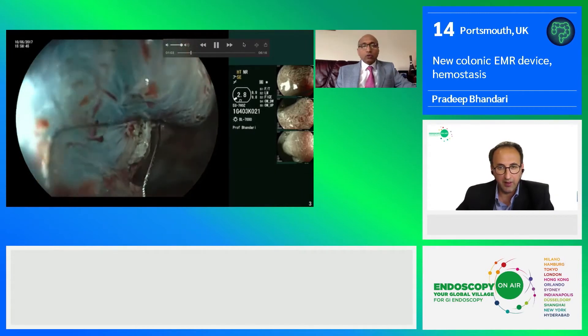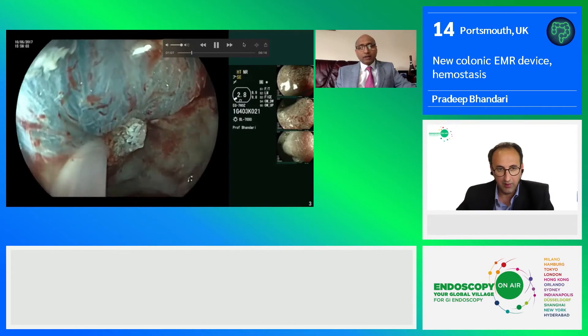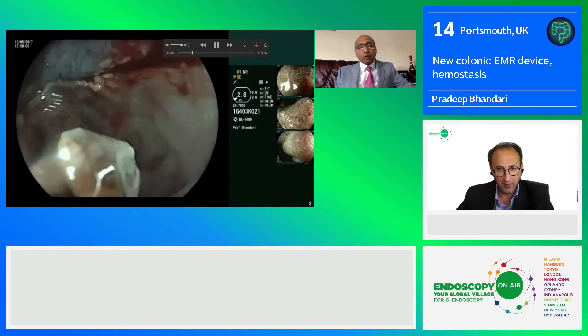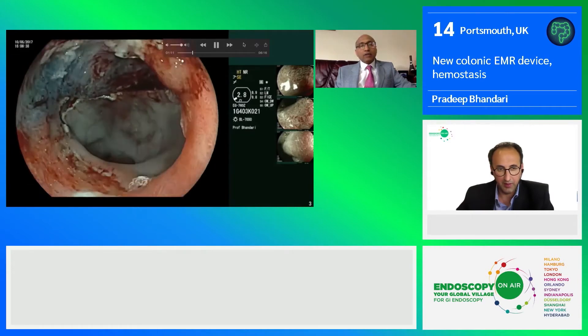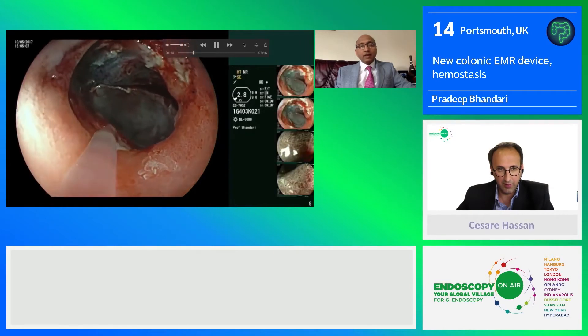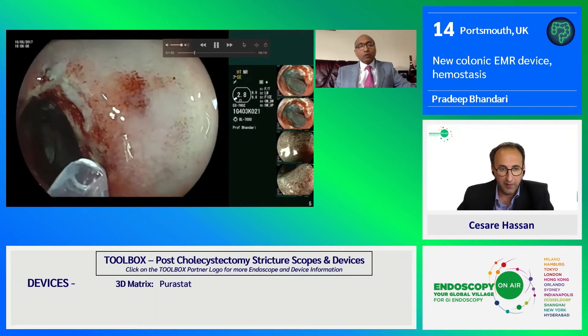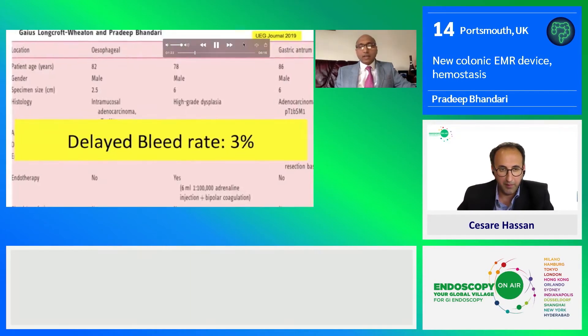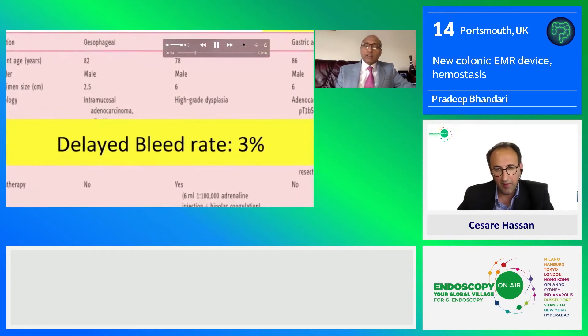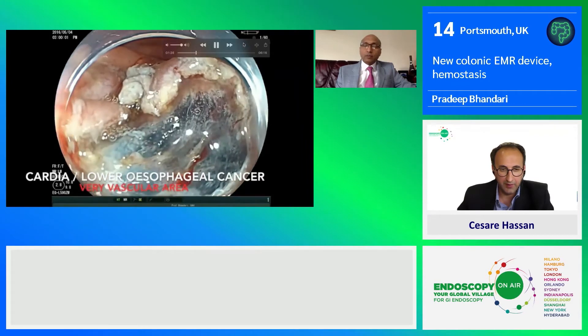You saw a duodenal EMR from Michael Burke this morning. This is a very difficult scarred duodenal polyp which we resected by cold EMR, hot EMR, and knife. There is about a thirty percent risk of delayed bleed here. We use PuraStat as a routine in such high-risk cases and showed that our delayed bleed rate dropped down to less than three percent.